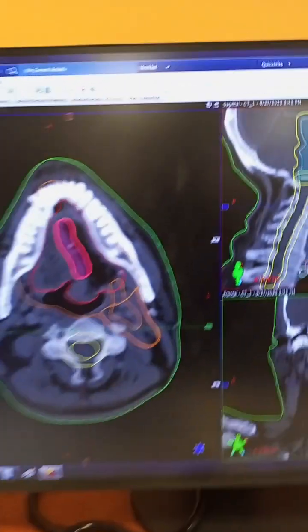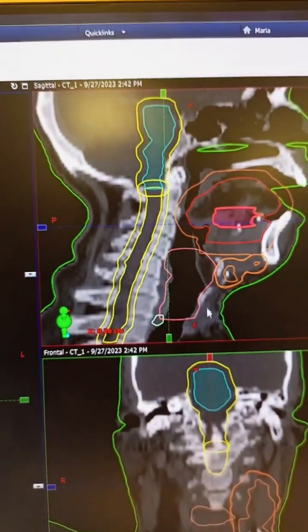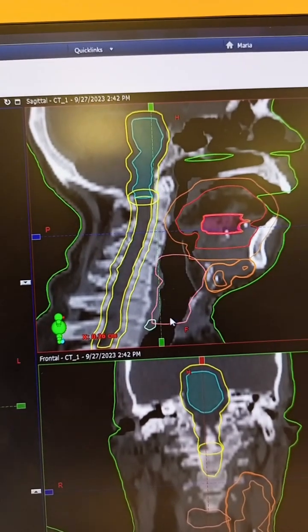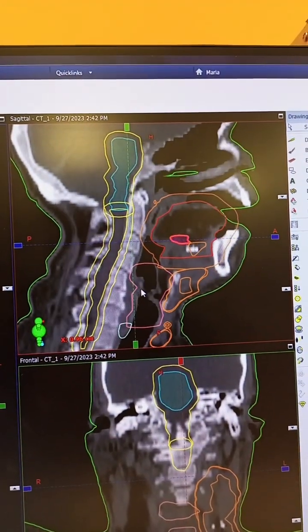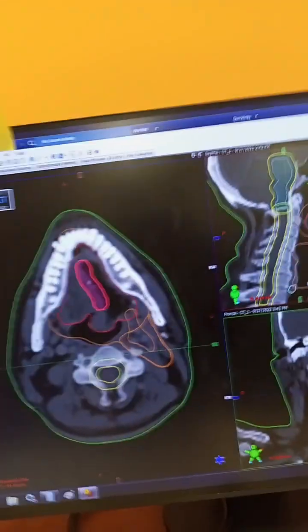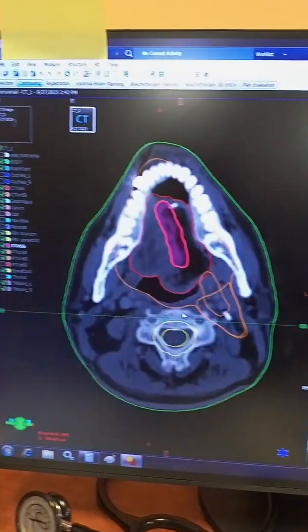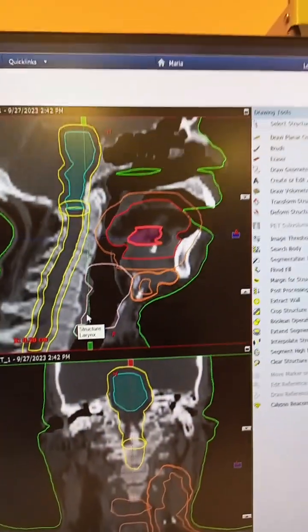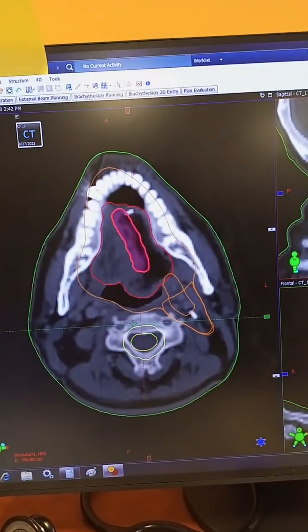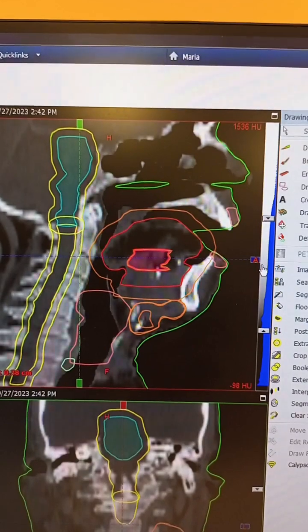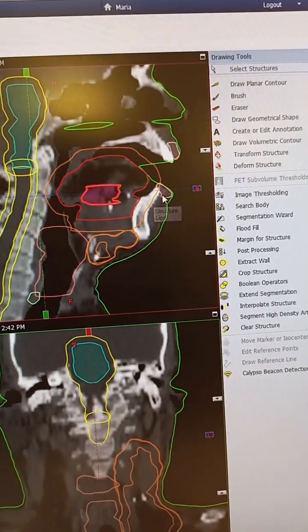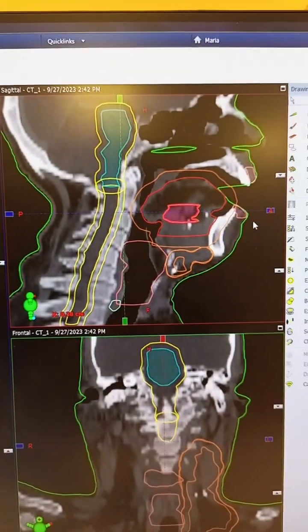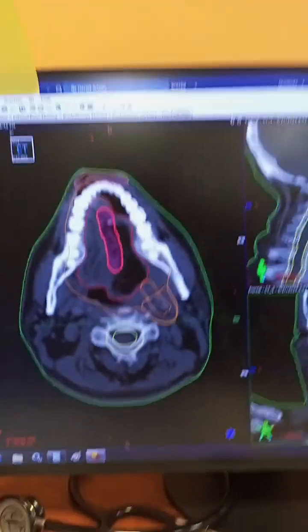We have drawn the larynx, which begins from the laryngopharynx. The larynx is important because it is the sound box of the patient. You can see the epiglottis, the vocal cords, and the larynx. We have also drawn the lips, which are also organs at risk for this carcinoma tongue case because if radiation is being delivered from the anterior direction, the lips are also at risk.